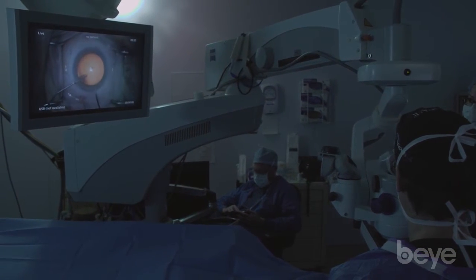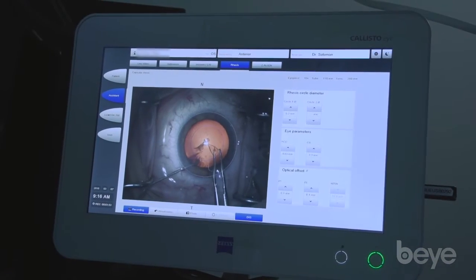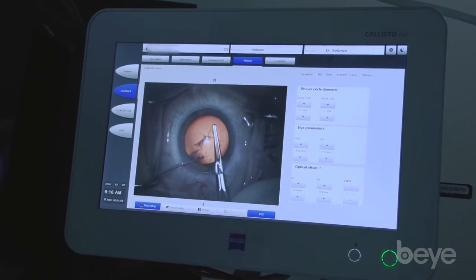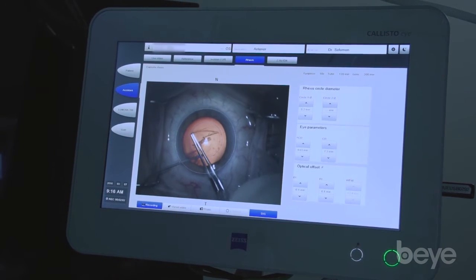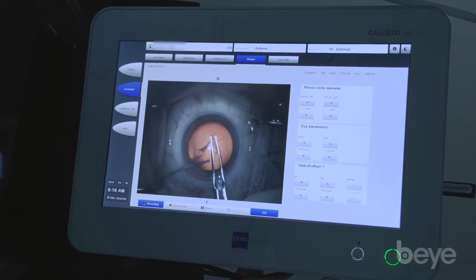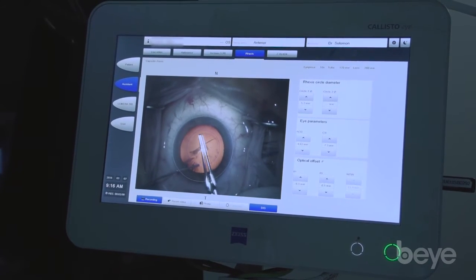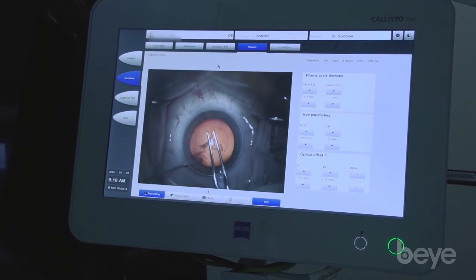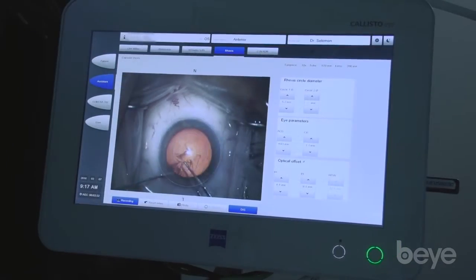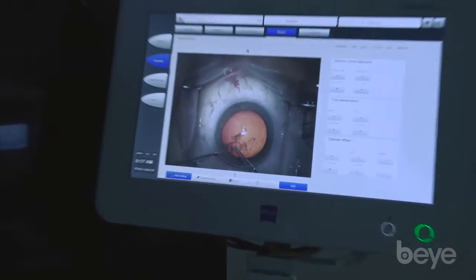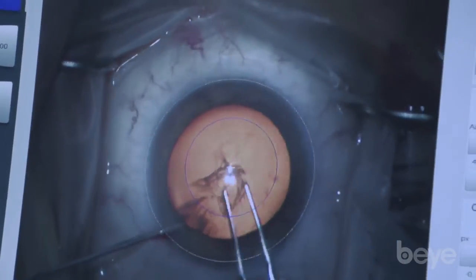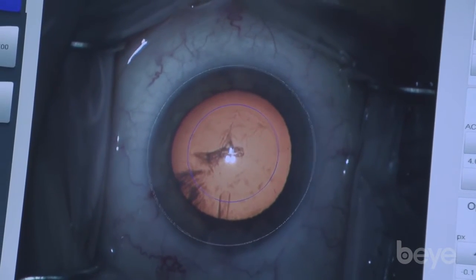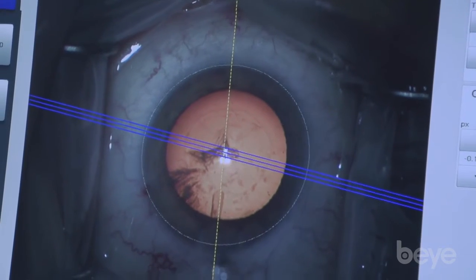I like to do a bi-manual approach — it gives me confidence to maintain and fixate the globe. It's particularly helpful when you have young training physicians observing. I think it would have been incredibly helpful when I was still training or early in my career to have a tool such as this. You can see how user-friendly it is. You're taking the data from the IOL Master, which is certainly the leader in the field for preoperative biometric data, and that's where we know we're going to be placing our toric IOL.